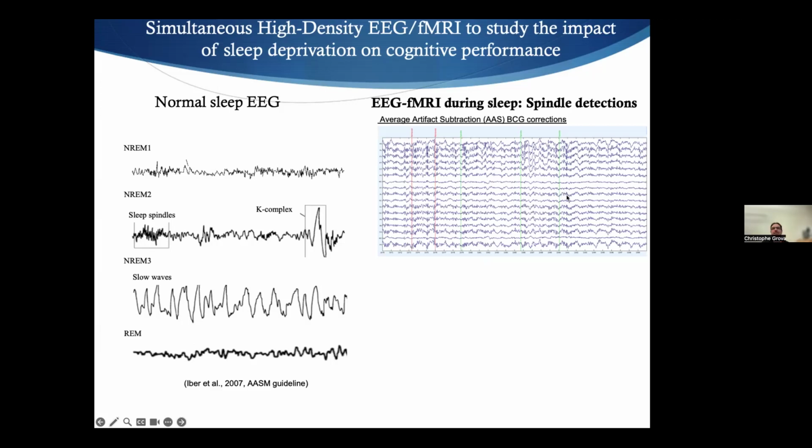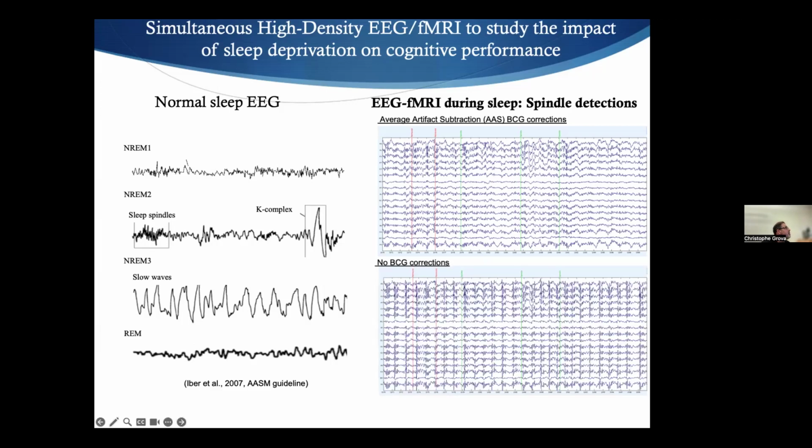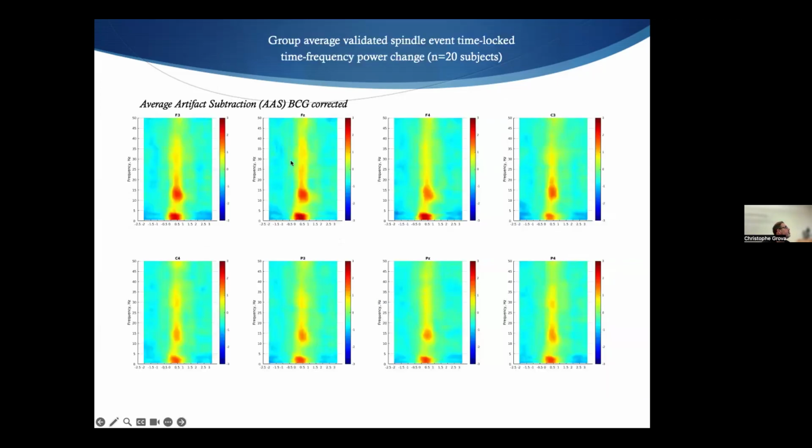But you see, it's not clear, and even our experts were not sure. So this is after AAS subtractions. Of course, if you don't apply any AAS subtractions, it's even worse. Try to find out where your spindle is here. It's completely impossible. So then what Makoto did is he averaged several spindles, and he made time frequency representations.